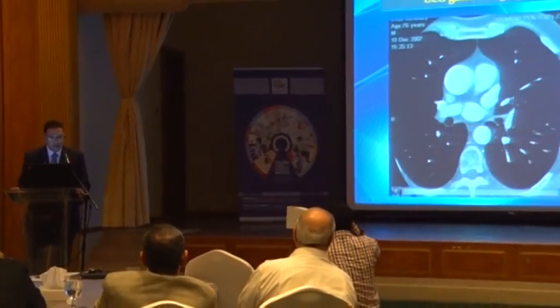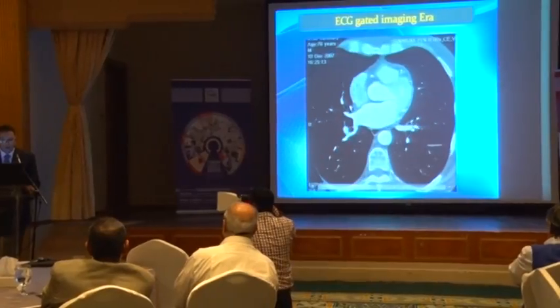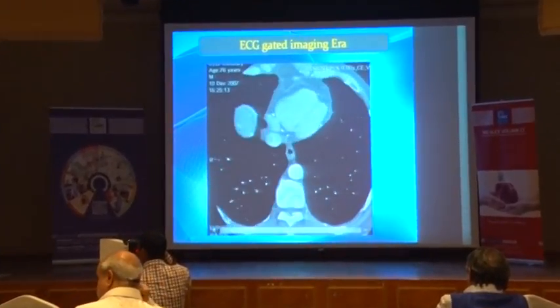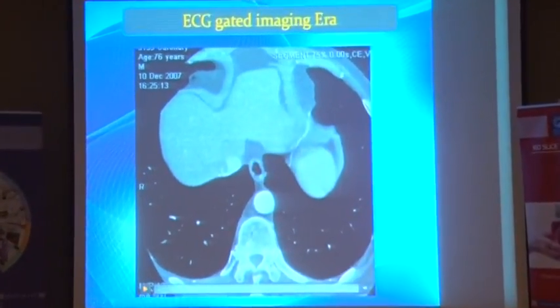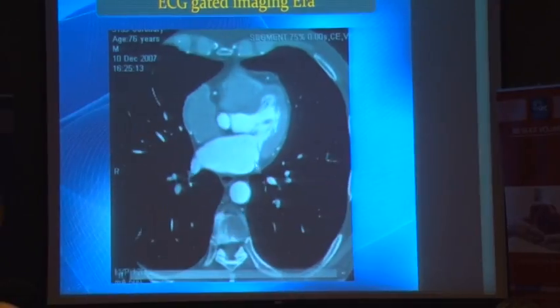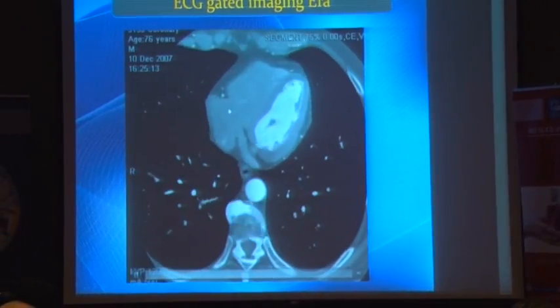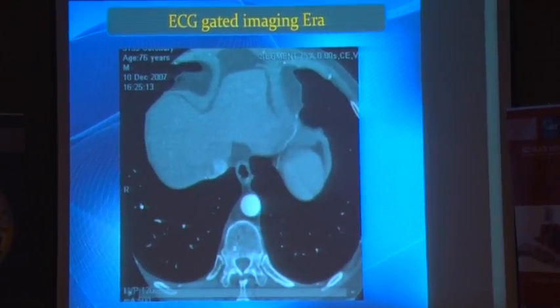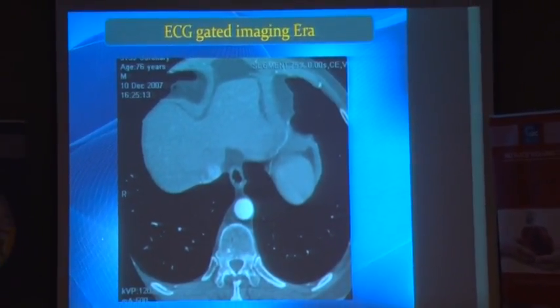Anatomy is rather easy. This is the aorta, this is the pulmonary artery, left ventricle, left atrium, in which the 4 pulmonary veins are entering, which is a normal situation. You can see the 4 pulmonary veins nicely, and the right atrium in which the coronary sinus is entering. This is a little summary of the anatomy of cardiac imaging.